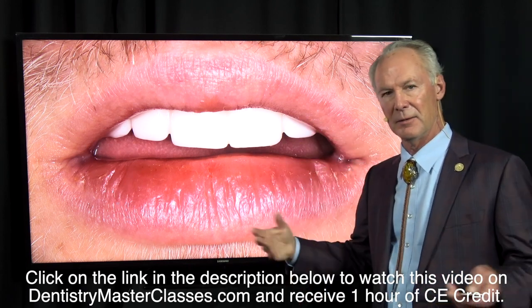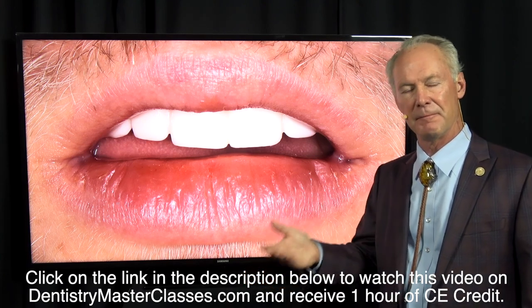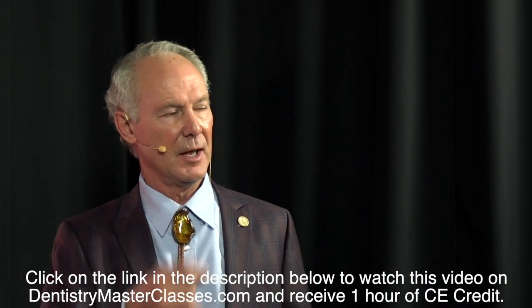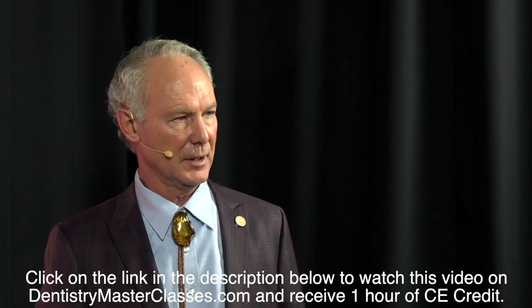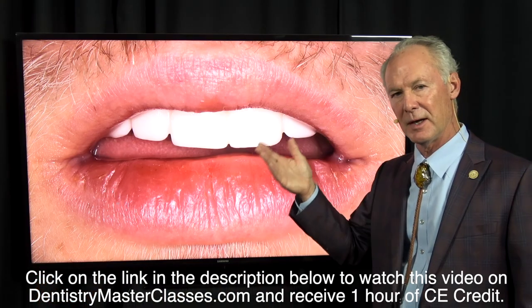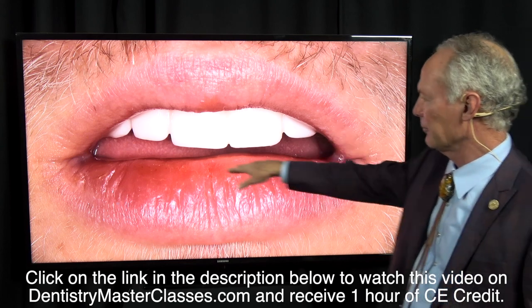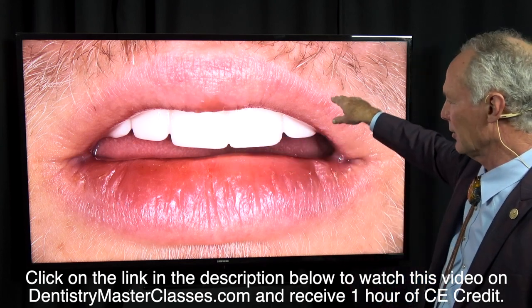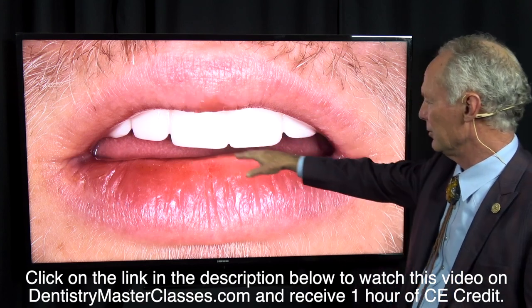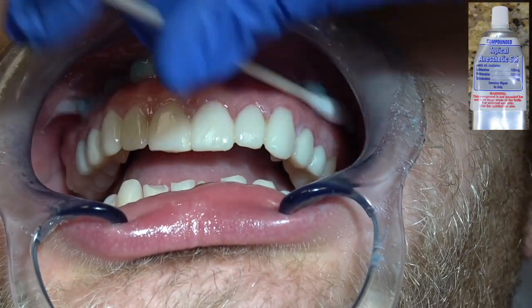You can look up lip position in relation to incisal plane in the library at dentistrymasterclasses.com, where I talk about the three different types of lips, the flat, the moderately arched, and the maximally arched, in relation to incisal plane. Remember, you always want the incisal plane to basically mimic the lower lip and be in the shape of a banana or a quarter moon. You want the centrals to be the longest teeth. Watch the video on fundamentals of aesthetics.